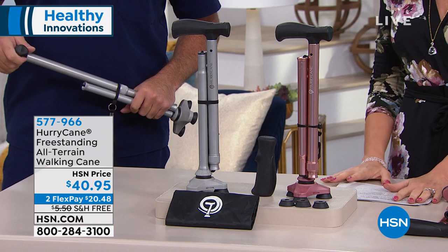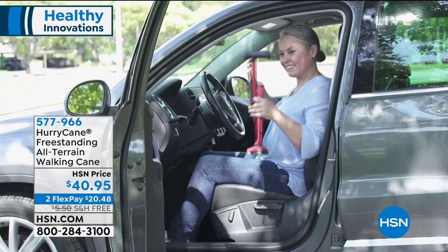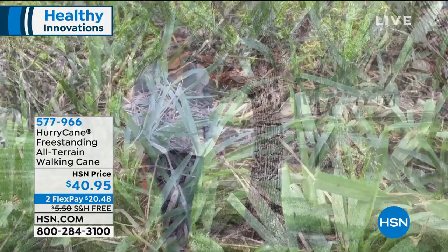It's almost like getting a brand new replacement cane because really what you would need to replace is the handle or the feet. It's $20.48 on flex, and we're going to ship this one to you for free, so you're saving $5.50 on shipping. Item 577966.